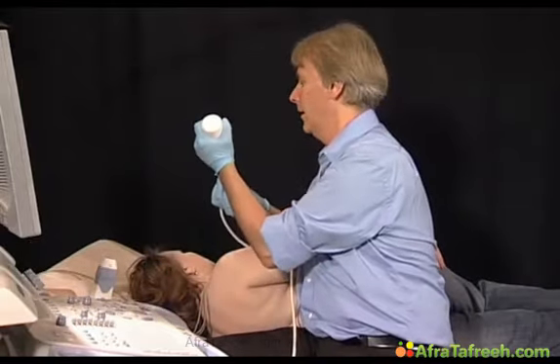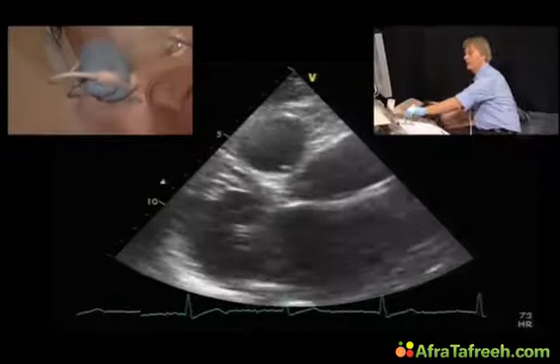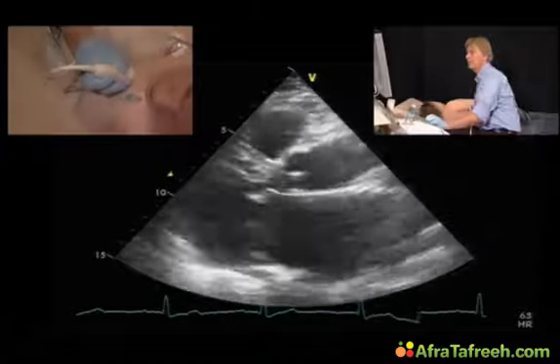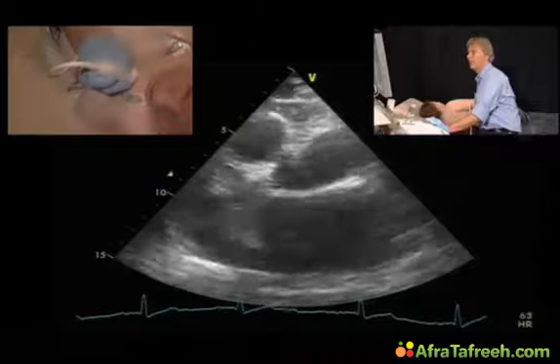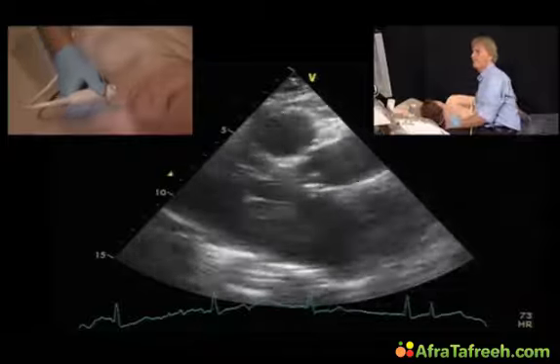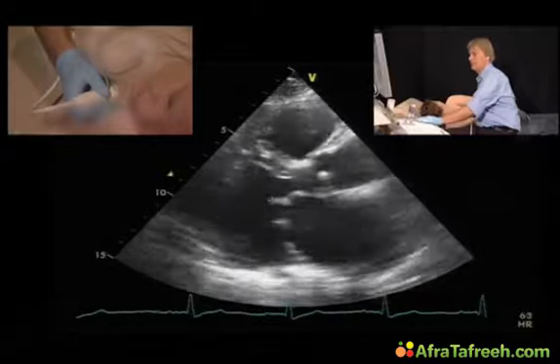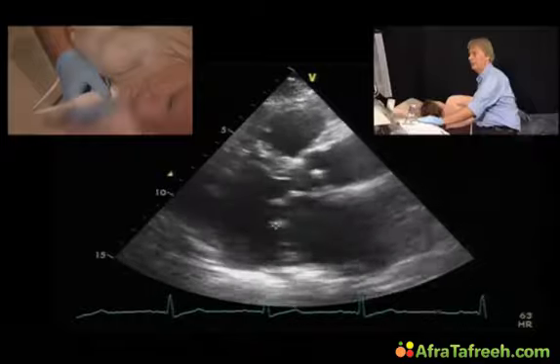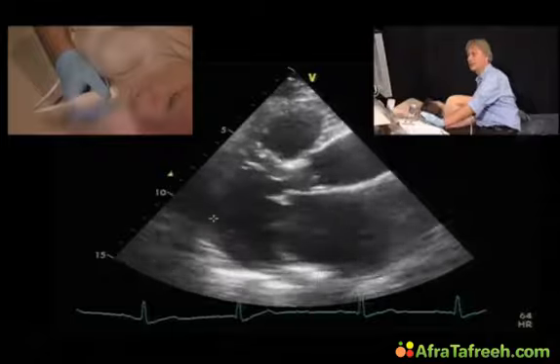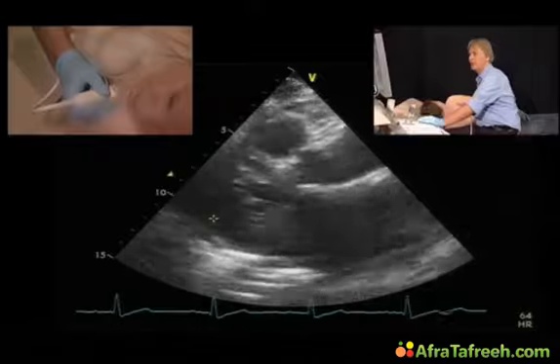It's actually quite difficult to really perform planimetry of the mitral valve, and you have to consider a few things. The first thing, always look at the parasternal long axis view first, because there you get a good appreciation for the opening motion of the mitral valve. And in our patient here, we can see that the mitral valve does open quite nicely. You see the anterior and the posterior leaflet separate quite nicely, so it does not look as if stenosis is really severe.